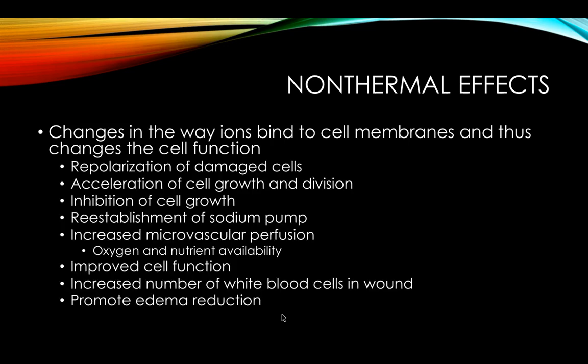Okay, so things like repolarization of damaged cells, we know that that is a problem when we have an injury, that the cells don't depolarize in the same manner, and so we get that repolarization of that. So it helps sick cells essentially get better and return to normal function.